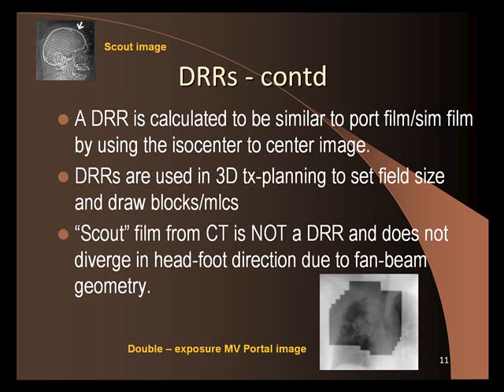But the ultimate purpose of these is to compare with a port film. You've heard of port films? A port film is a film that's made on a radiotherapy accelerator that shows you the shape of the blocks and shows you where the isocenter is on a patient. Port films aren't very clear, and they're usually a little bit blurry. Why do you think they're blurrier than that? Look how sharp that is. Of course, it's a different area of the body, but it's because you're using MV. The problem with MV, and the reason MV doesn't give you contrast, is because the energy is so high.